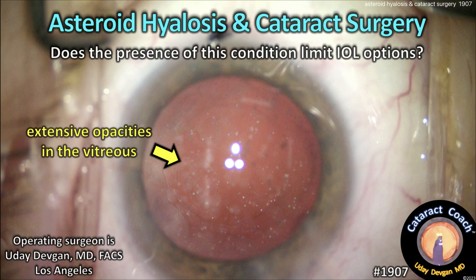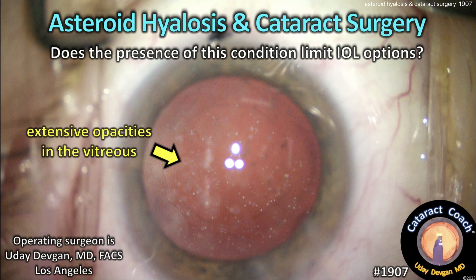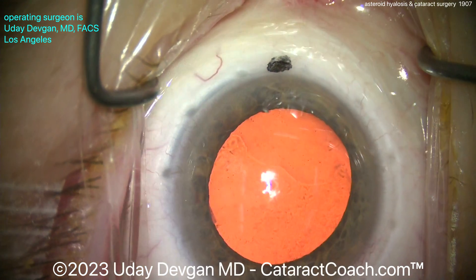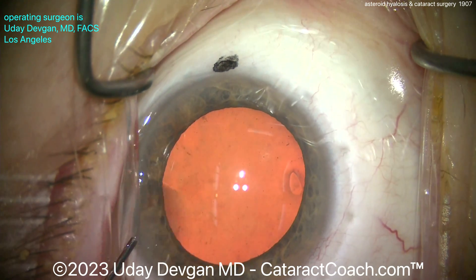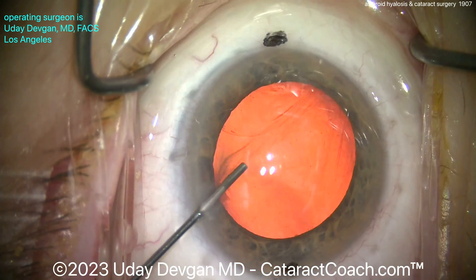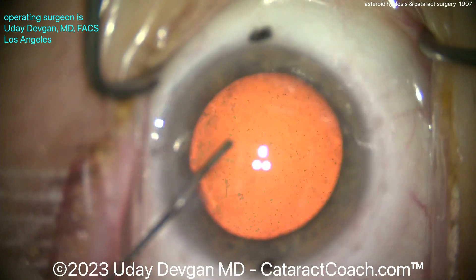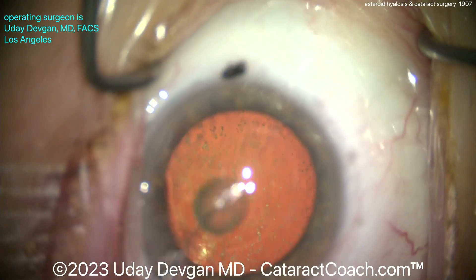cataractcoach.com: asteroid hyalosis and cataract surgery — does the presence of this condition limit your IOL options? Here's our patient, looks like a routine cataract with ink marks at the 180-degree meridian. Everything looks pretty normal, but if you look behind the lens at that red reflex, you may notice there are a lot of these refractile bodies. Look at all that — those are the asteroid hyalosis deposits.